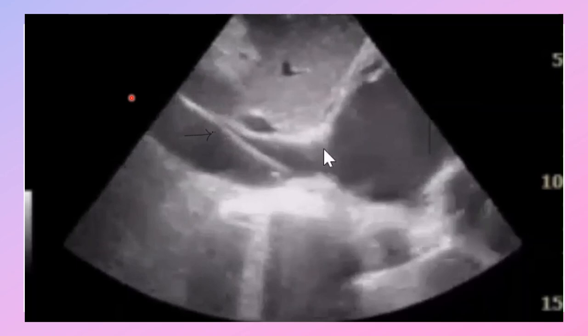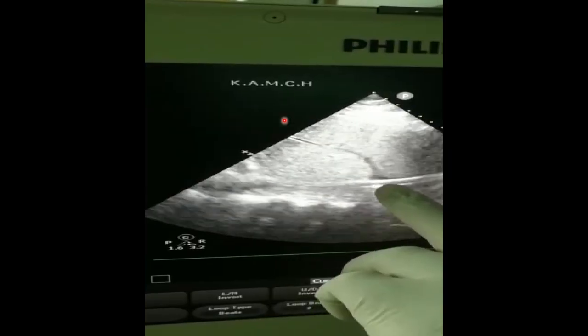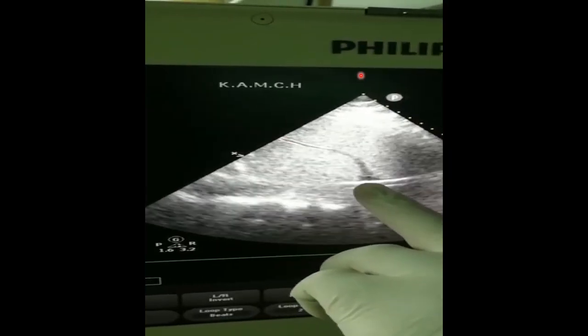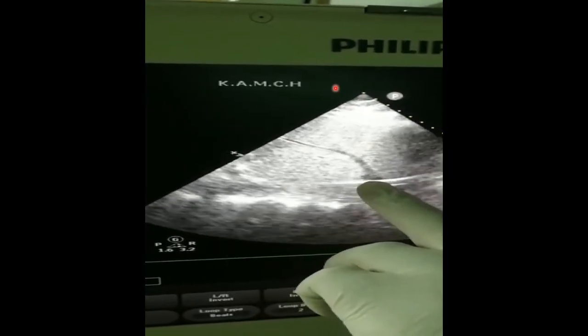This picture shows the guide wire seen in the inferior vena cava with ultrasound during ECMO insertion, at the junction between the inferior vena cava and the atrium. Although this is not common practice, it is preferred to confirm the cannula is positioned in the inferior vena cava and the right atrium.